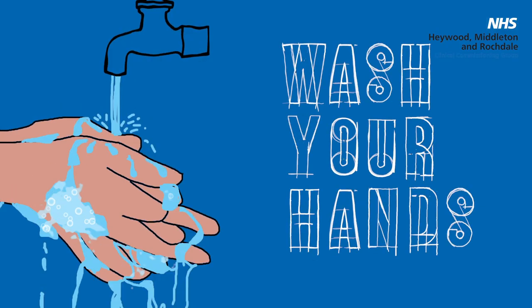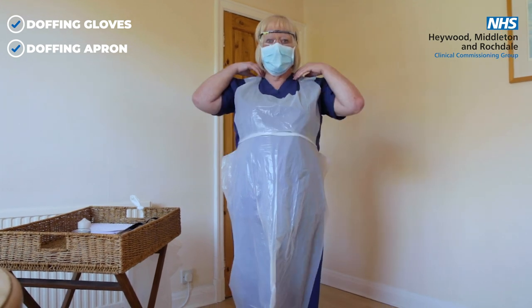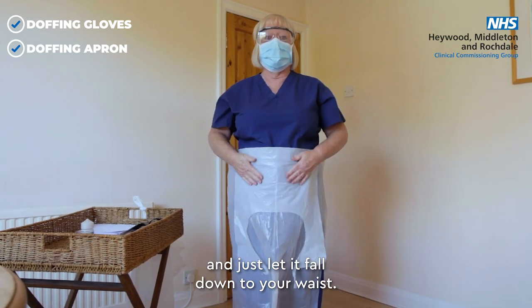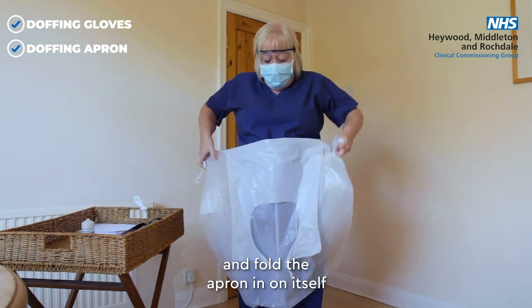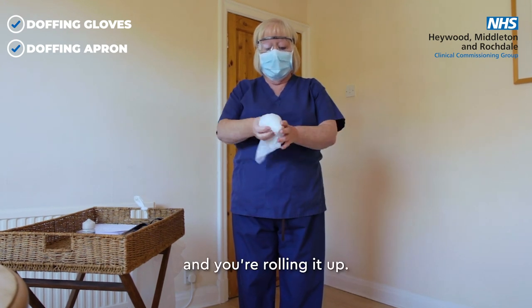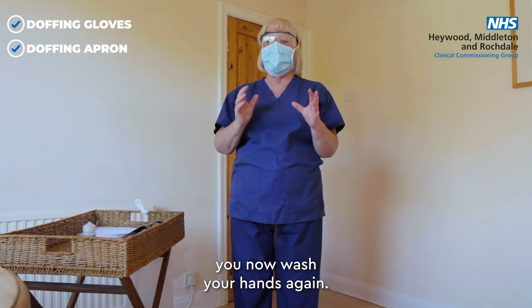You then wash your hands. The next most contaminated item is your apron. Put your hands behind your neck and snap the neck tie — it will come off very simply and just let it fall down to your waist. Then snap the back, fold the apron in on itself so you're not touching the outer surface, rolling it up. Dispose of it in your clinical waste, and then wash your hands again.